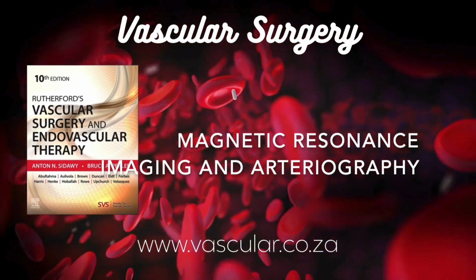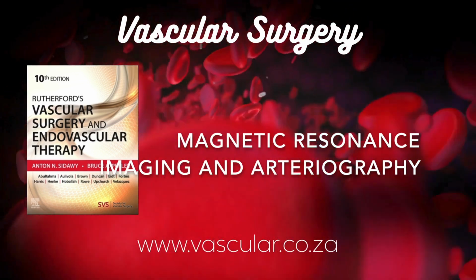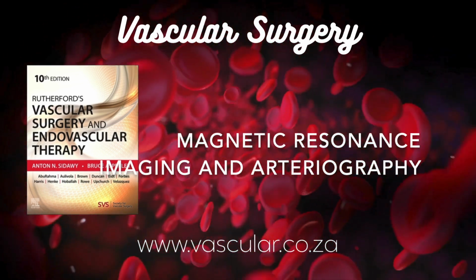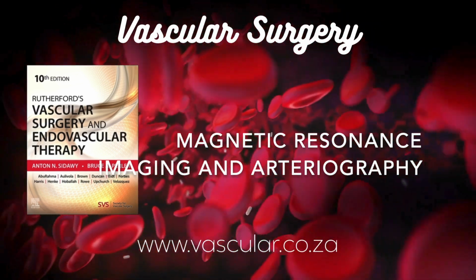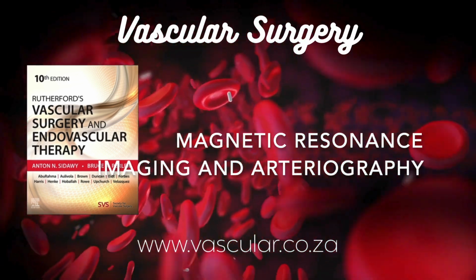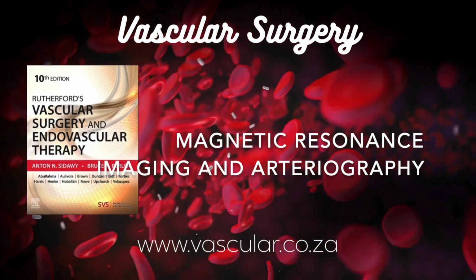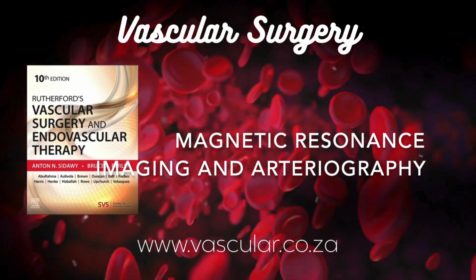There's a lot of interest in blood pool contrast agents, BPCAs. Blood pool, they stay in the blood longer. Exactly. They're designed to remain intravascular for much longer periods. This could allow for longer, higher resolution scans, maybe getting both arterial and venous phases clearly in a steady state. Any examples? One was gadofosveset, which binds to albumin in the blood.